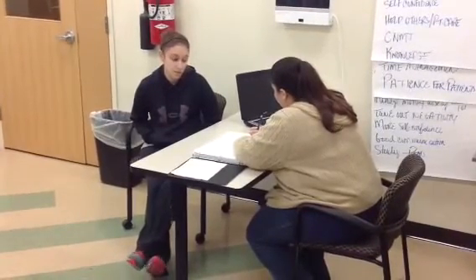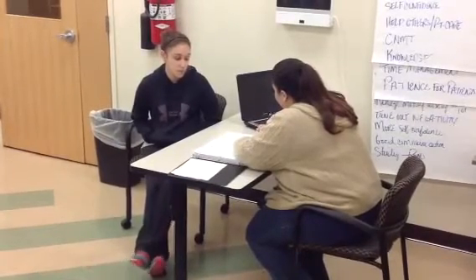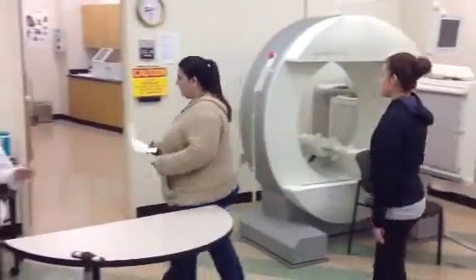A lung perfusion study is used to image arterial blood flow in the lungs. A radioactive material is intravenously injected in the patient. It combines with blood in the heart and is distributed via the pulmonary artery into the lungs.